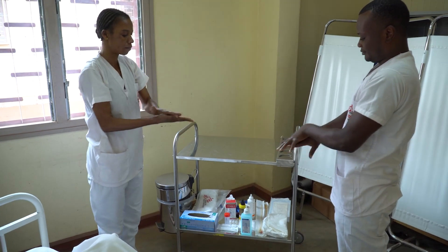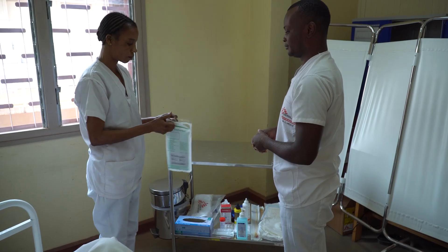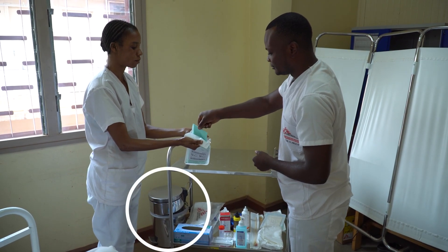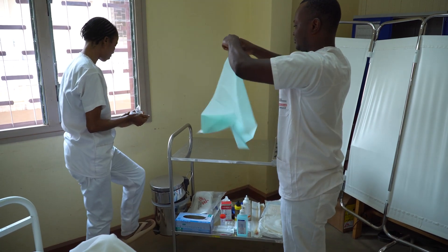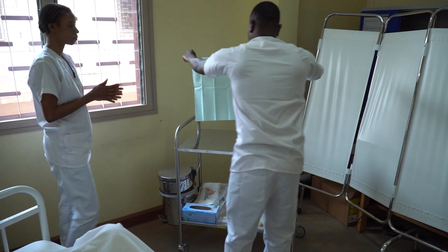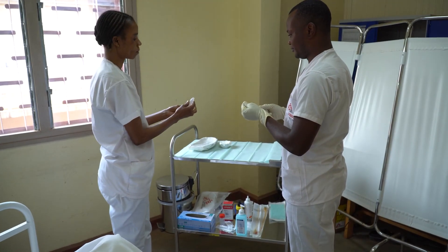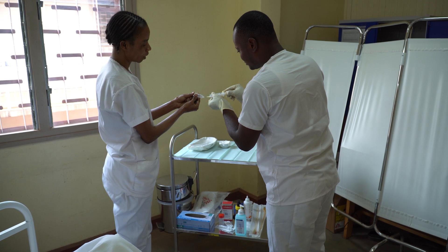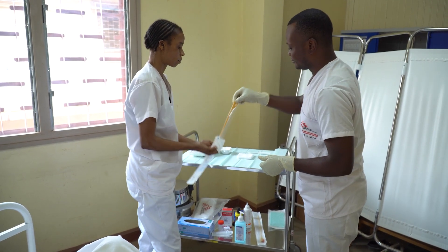First, we start by performing hand hygiene because we are about to begin a procedure. We bring the trolley or the tray to the patient's bedside and position the waste bin so the waste is not moved across the aseptic field. Place the sterilized drape on the top shelf of the dry trolley. Using an aseptic non-touch technique, also known as ANTT, prepare the appropriate amount of sterile water for injection to be injected into the balloon with a needle and syringe. Then prepare all other equipment using ANTT.